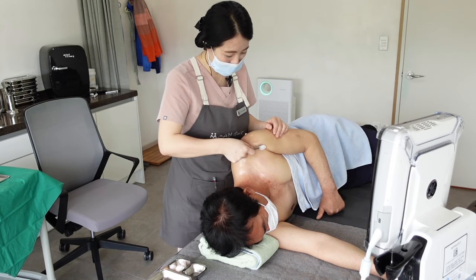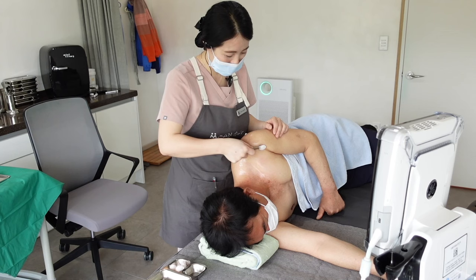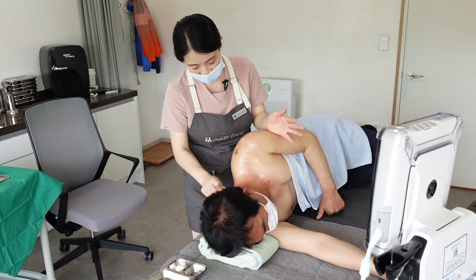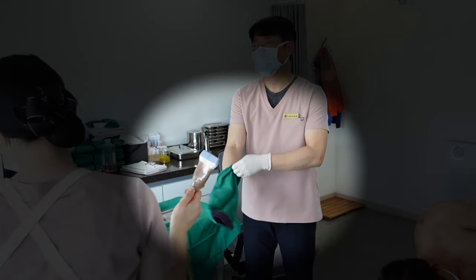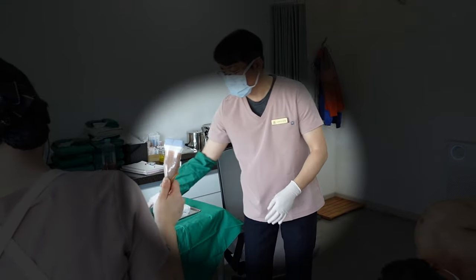There is nothing more important than safety. She is rubbing the skin with cotton balls containing a mix of alcohol and an aqueous form of chlorhexidine. I always wear a handmade aseptic probe sleeve.